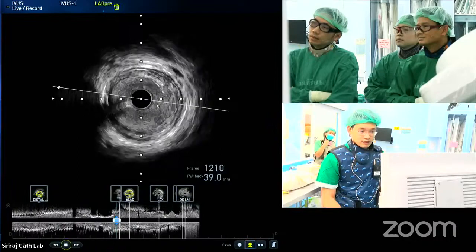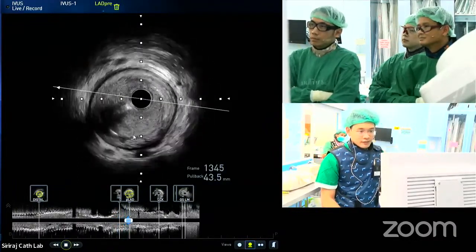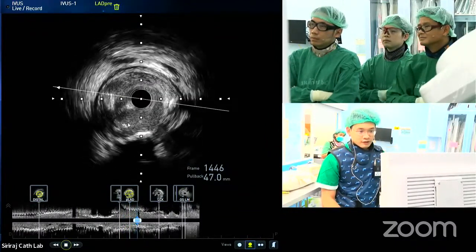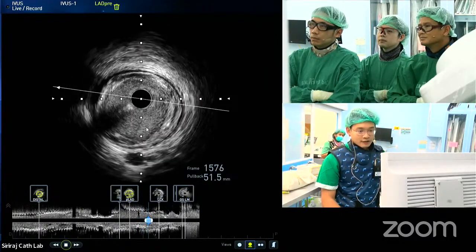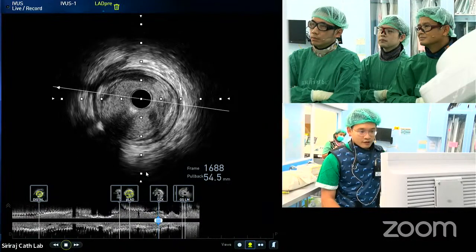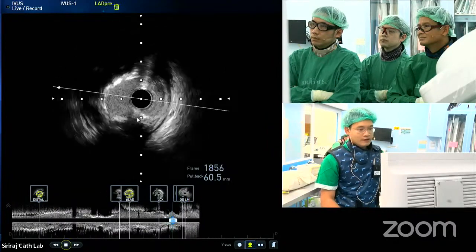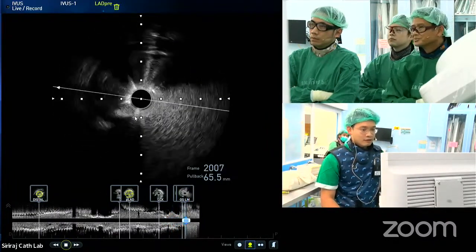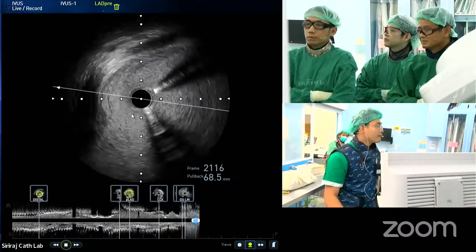Now the diagonals from the left hand is coming in, the big diagonal one, and this part, the proximal LAD, looks good, but with some plaque circumferential through the ostium. And then you can start from the circumflex here, and this is the distal left main, which is very tight stenosis. And also has some calcium, circumferential. That plaque extended to the ostium of the left main.